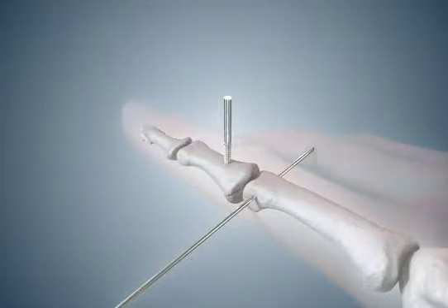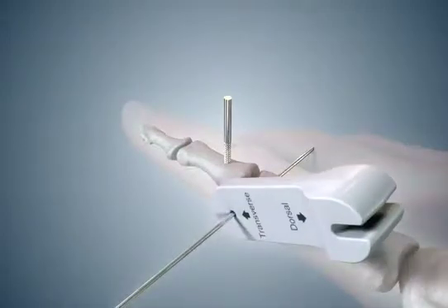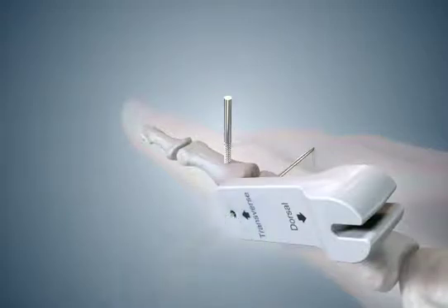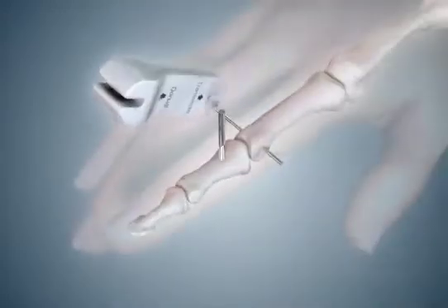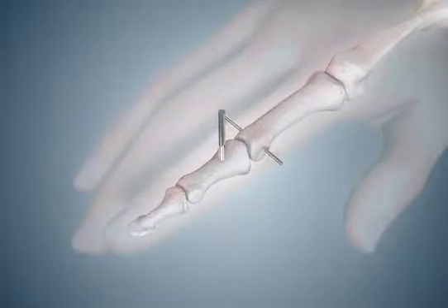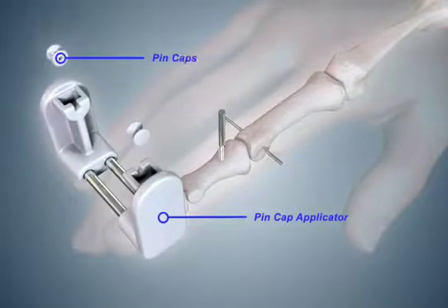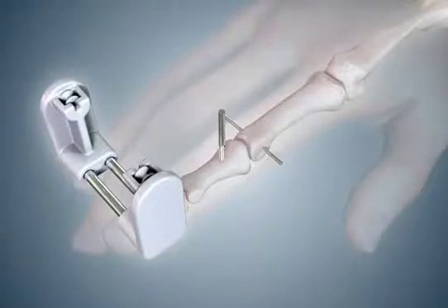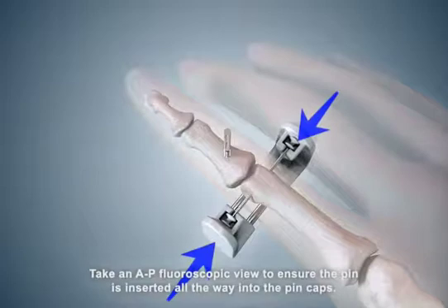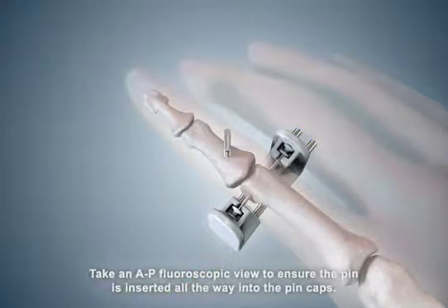Place the thin end of the spacer over one end of the transverse pin and cut the pin off flush with the spacer. Repeat on the opposite side of the finger. Select the pin cap applicator and pin caps. Place the pin caps into the applicator with the holes facing each other. Then align the slots in the pin cap applicator with both ends of the transverse pin. Firmly squeeze the pin cap applicator until both pin caps are pressed onto the tips of the transverse pin.